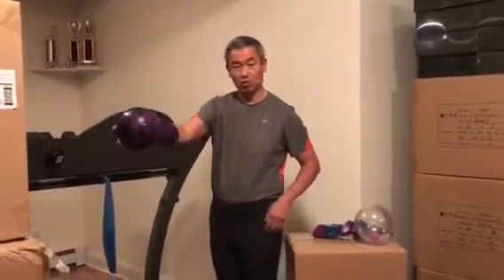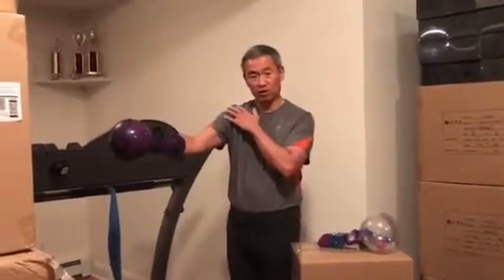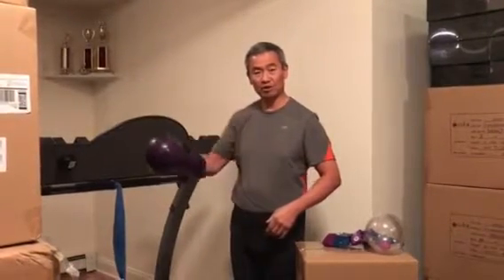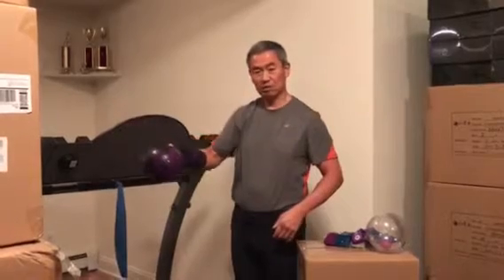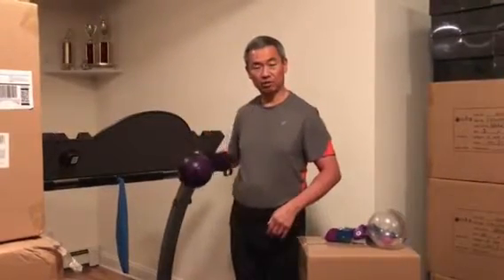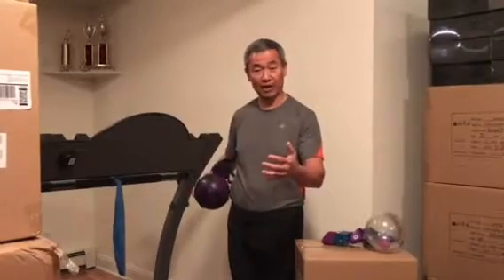So you do the front and back. I bounced, so I will start again. You need to go all the way up to the front here where the arm is straight forward and pull back. So that's 1, 2, 3. Do 10 times of that.